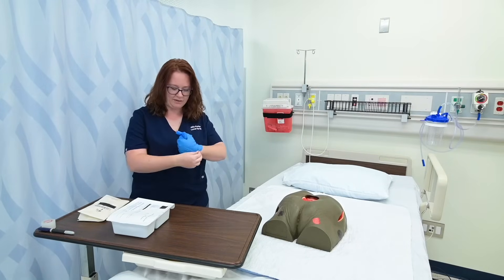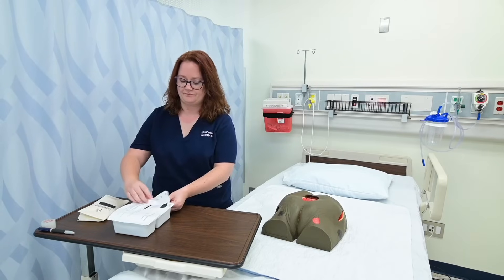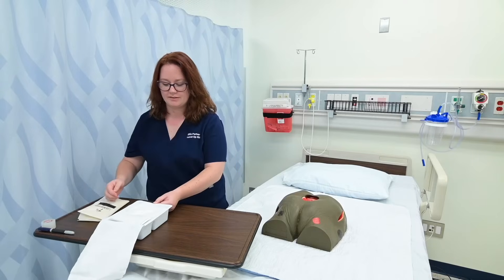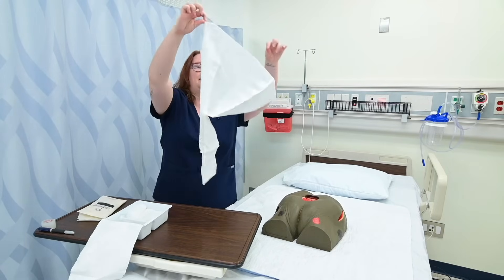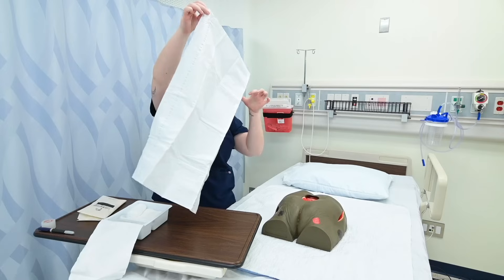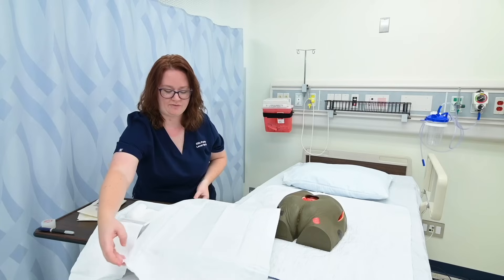I'm going to go ahead and take off my gloves and start to prepare my sterile field. The first step is to open my wound care tray. I'm going to pull it away from me and pull it taut. These trays usually come with gloves, but I prefer to wear the size that fits me, so I've gotten extra sterile gloves. I'm going to go ahead and pick up my sterile drape — I can pinch these corners. Just remember, one inch of the sterile border is not sterile. I'm going to lay that out for me to use.